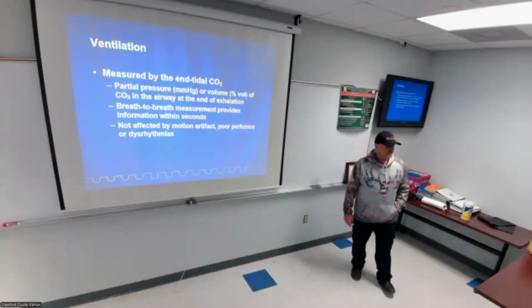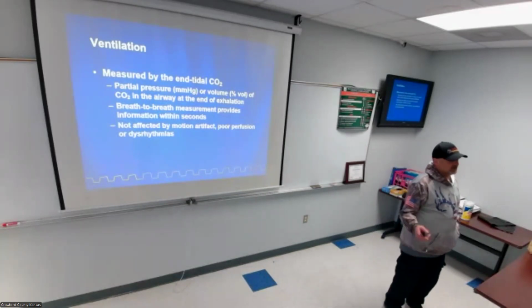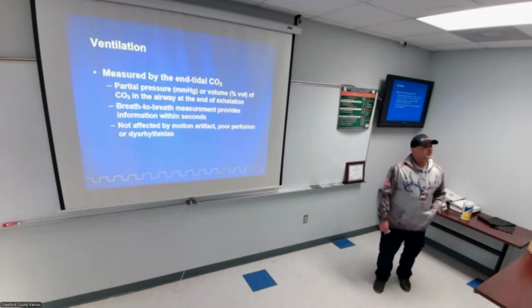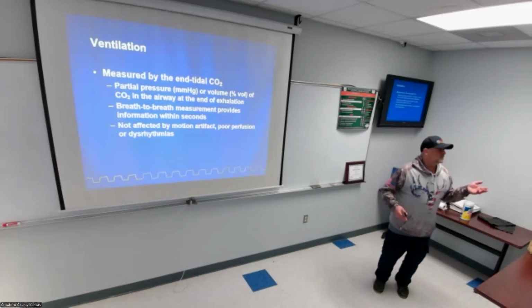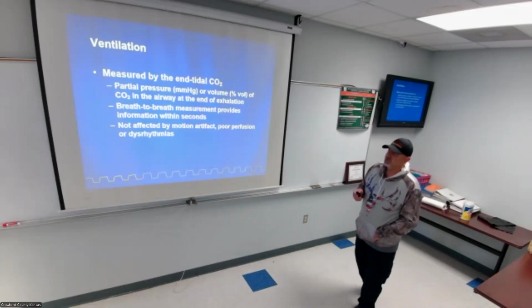I don't know what makes a difference. I just ask them to try to breathe in their nose, out their mouth. That's what I'm gonna do too. I said, hey, can you just exhale out your nose, exhale out your mouth? I tried it both ways. When you first put them on, you'll get a low reading, and then all of a sudden it goes back up to normal. Then it'll drop down to 15, then it goes back to 24. I don't know if there's a really good way.